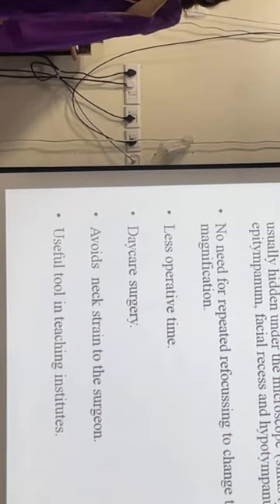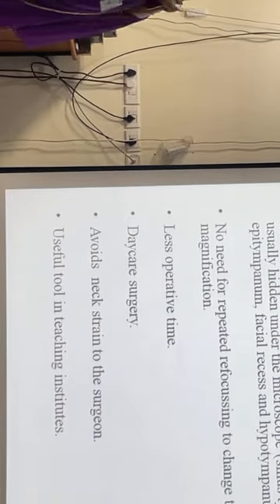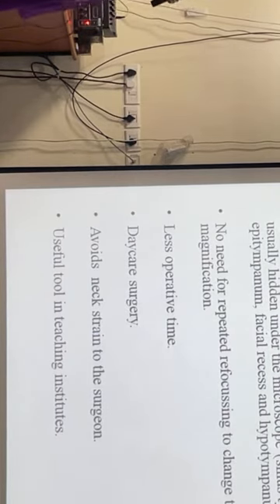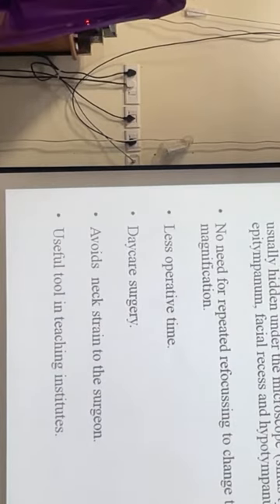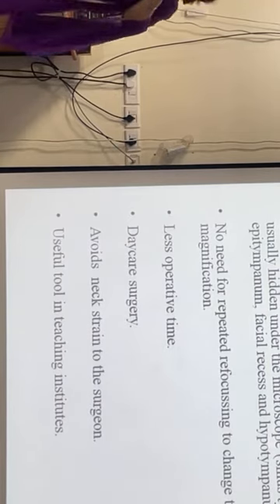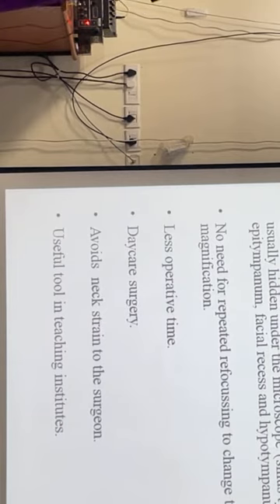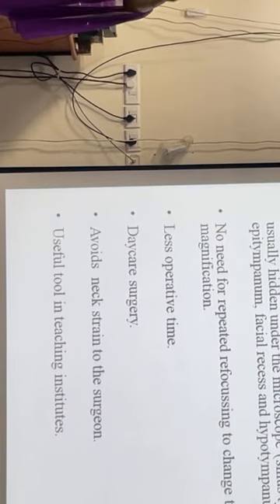No need to focus the microscope again and again. For an endoscope, you just have to increase the depth to go to a particular area, so there is no need to change the magnification. Less operative time, it is a day care surgery, and it avoids neck strain for the surgeon. When we enter our middle age, that's an important factor, the sitting position and the position of the back on the chair. In endoscopy, right ahead, you have the trolley and less strain to your neck and back. It is also a useful tool in teaching institutes where everything is visible to your students.